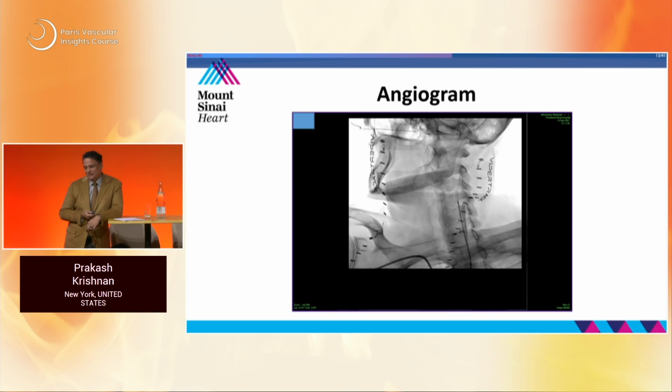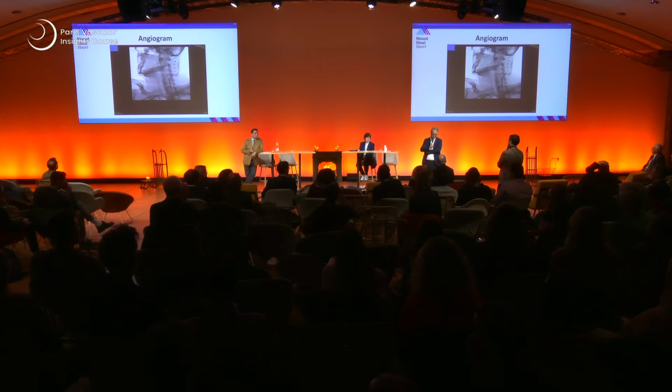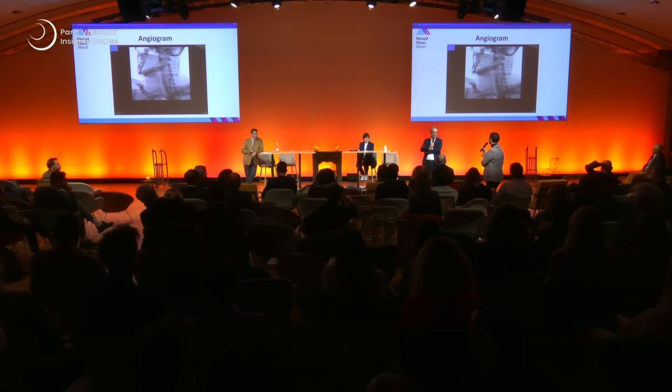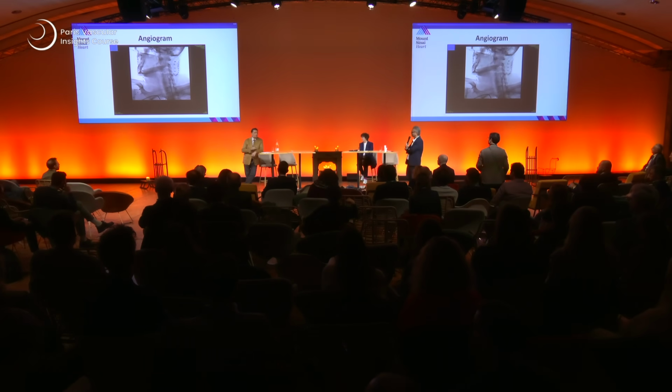So, as you can see there. So are you happy with the stenting? Because we've already seen data today from Piotr and others that it seems like there's still a lot of residual stenosis, like we would call it. What type of stent did you use? We used what's called the Abbott stent. Which one? The Aculink or the Exact? I believe it was the Exact stent.